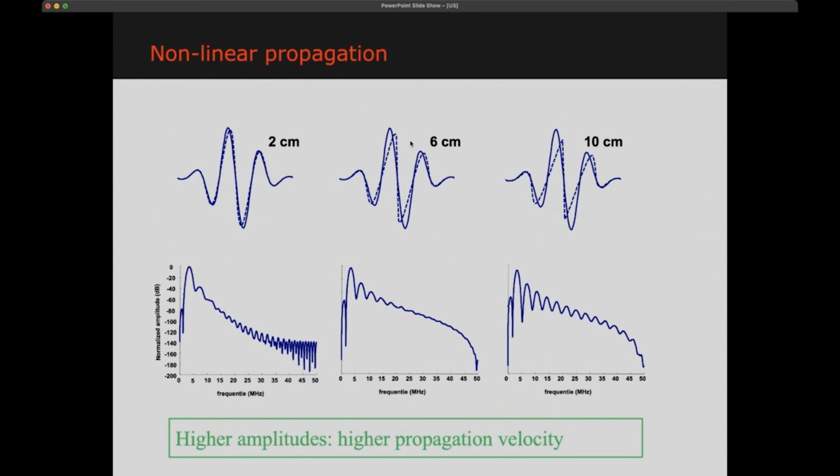Here, this is shown with a more realistic sound wave. In reality, we take the transducer and, for example, put an electrical pulse on it. So the transducer starts to immediately move. Its main frequency is, of course, this sinusoid, which would be the resonance frequency. But of course, it has more frequencies. And so it actually has this kind of sinc function-like shape in reality. So we have a certain pulse. This is our ultrasound pulse.